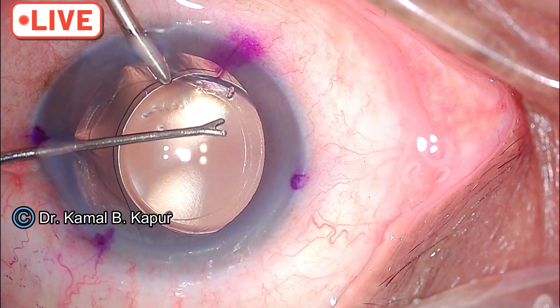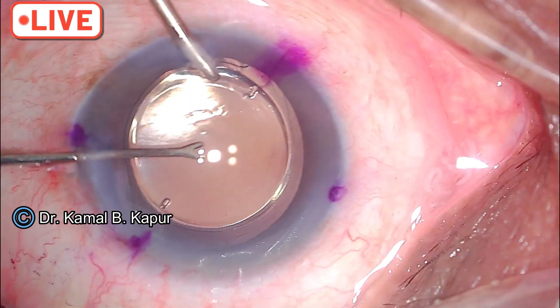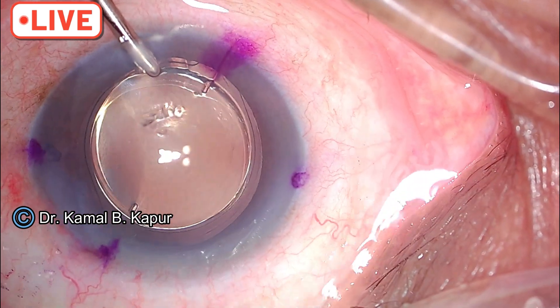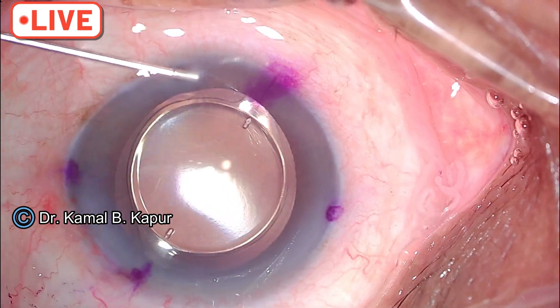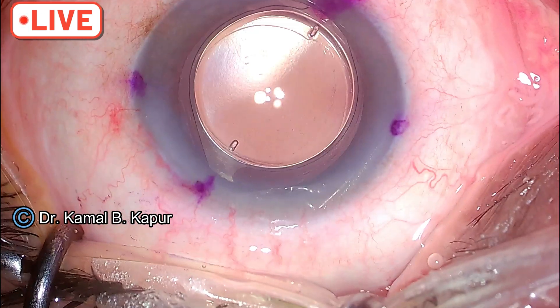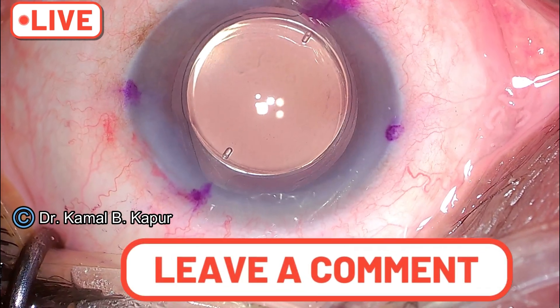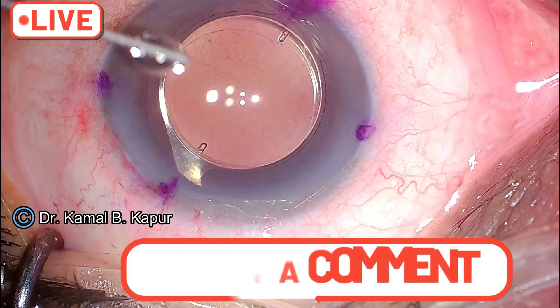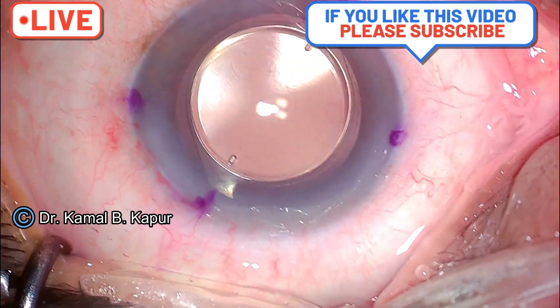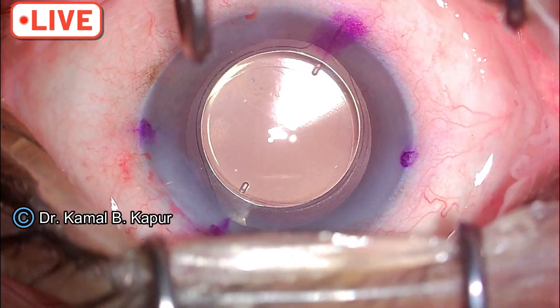This is approximately three weeks post-operative. We've rotated the lens and as you can see the lens is now aligned. Sometimes if the case is recently operated you can avoid using viscoelastic and just use your two side ports — no need to open the main wound. The primary axis was marked by the slit lamp, the secondary axis was marked on the table, and there you are — redialing done.